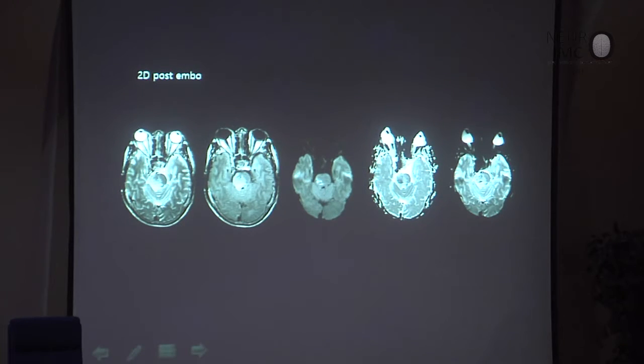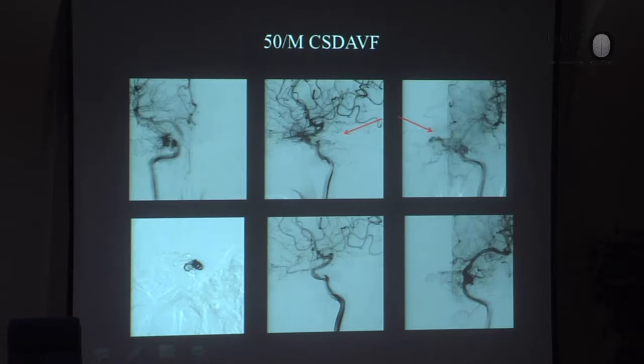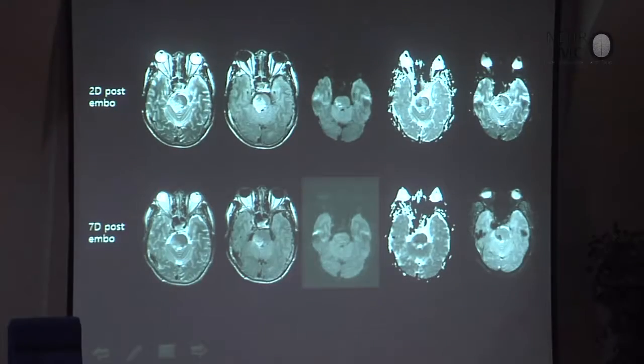The edema on DWI shows this is a venous nature of the lesion. So we did another angio. Now it's definite: the rerouting of the vein around the brainstem into the deep venous system. It was not easy, but we entered the cavernous sinus and put in more coils, and then could obliterate the residual lesion. And then the patient recovered almost completely later on.